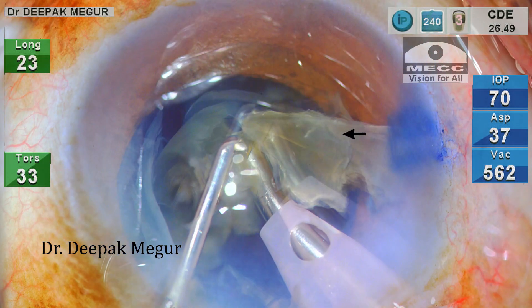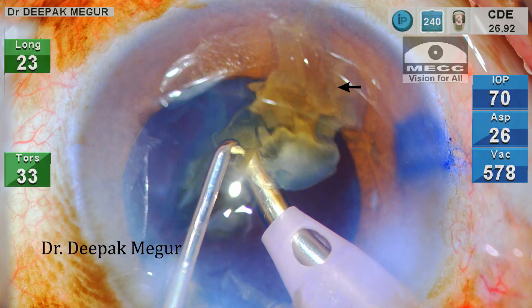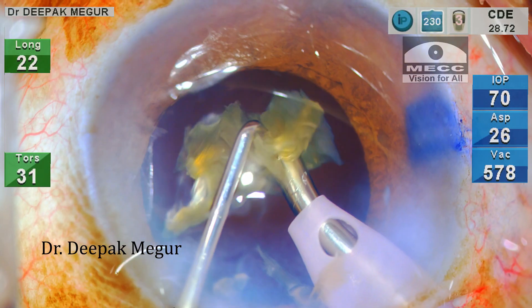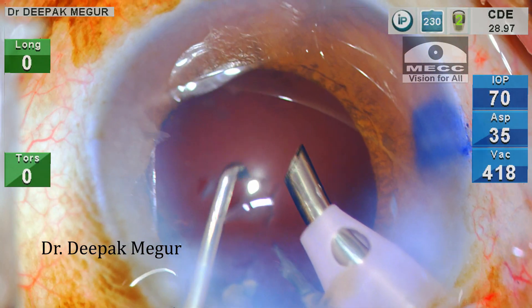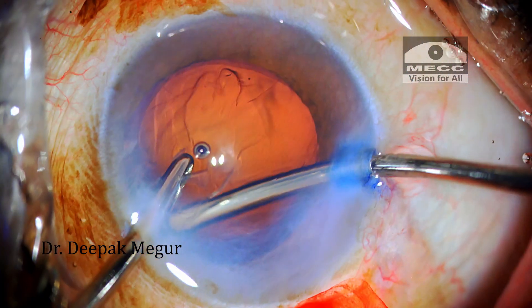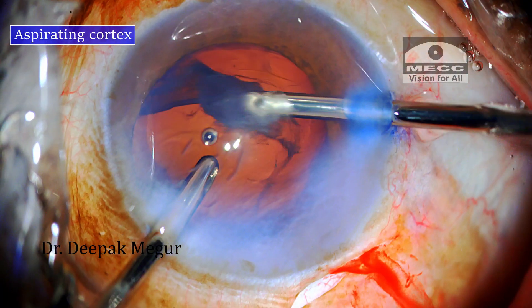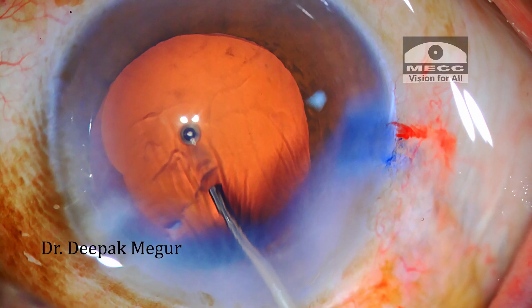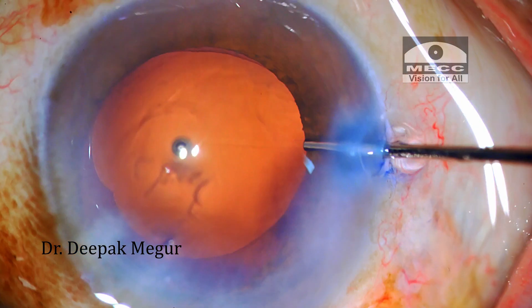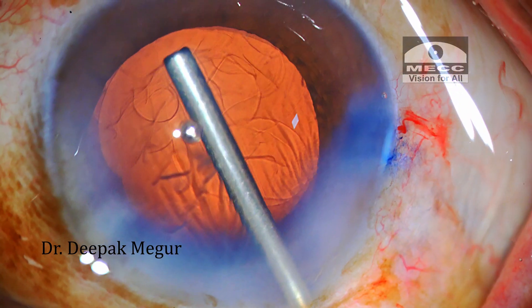Now we can see that there is an extra fragment which is out of the bag and can touch the endothelium at any time. Eventually, all the fragments were emulsified. A little bit of remaining cortex is then aspirated. There seems to be an area of corneal epithelial defect — I don't remember exactly when this happened, but nothing to worry about; it's going to heal on its own.